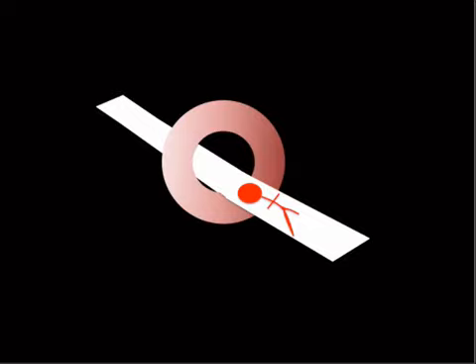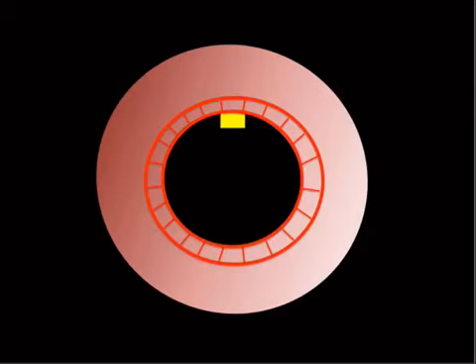The basic way it works is, the patient lies on the table, the scanner spins and the table moves. The detectors are very efficient. They're scintillation detectors. They obtain a ton of information, which creates a wavy mess called a sinogram. Then a bunch of math happens, the common one being filtered back projection, and then you get a picture.